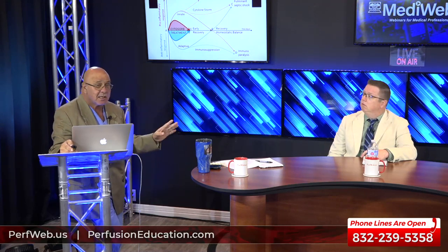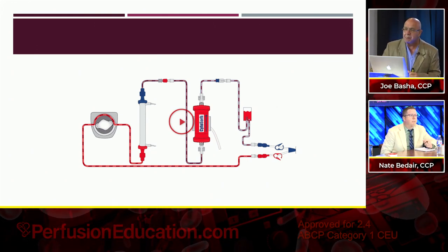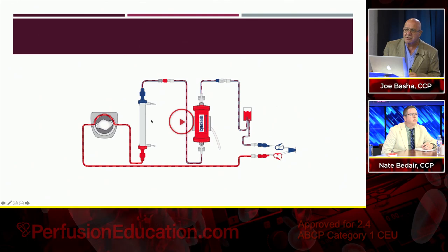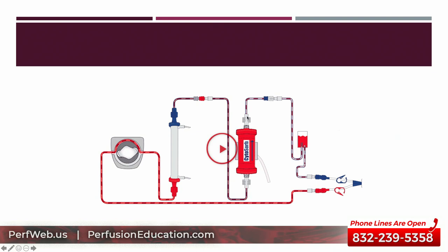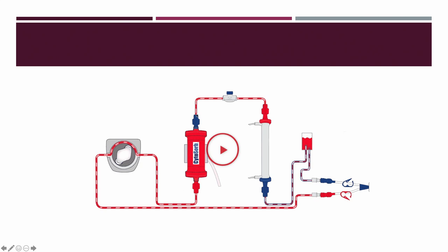Now, the CytoSorb is very easy to add to a CRRT machine, but you can do a lot of things with it. Let me show you what you can do. This was a video, but I just used an image. You can see that it draws blood from the patient. And again, you're going from red to blue. You're hemoconcentrating it if you want to, or dialyzing it, whichever you prefer. It comes down, goes into the CytoSorb filter, goes through this air deaeration chamber, and goes back into the patient. That's choice one. Here's choice two, where you go through the CytoSorb filter first, then you ultrafiltrate the plasma water or dialyze it, and then it goes into your deaeration chamber and back into the patient. This is just a typical, very simple loop, right?